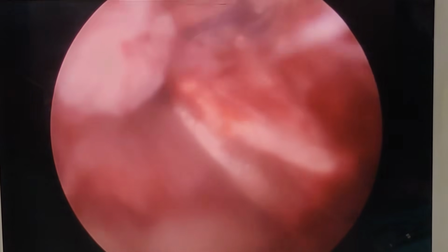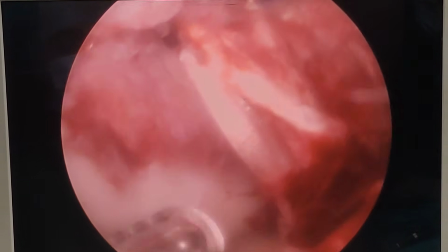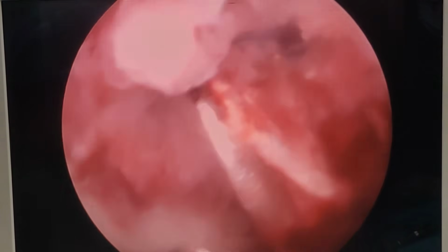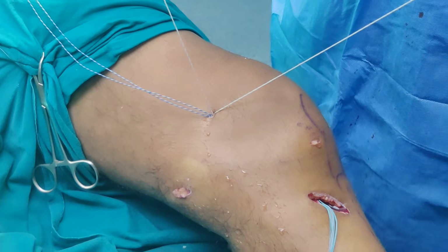So this is our graft, nicely recreated. I think it looks a bit red, but I can tell you this, that the graft size is beautiful, the sag is gone, and the knee is going to be extremely stable. So this is how you do a PCL. It has got a lot of critical steps which I think I have talked about, but hopefully this video will give you confidence in doing the procedure. So this is the end.